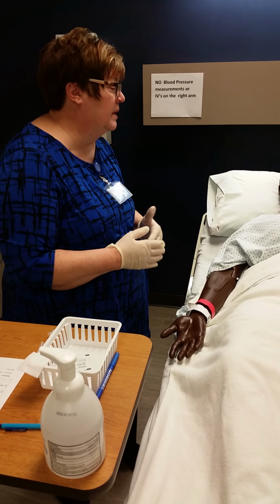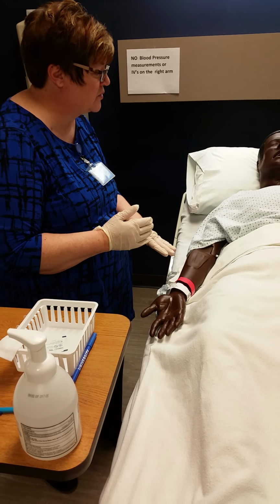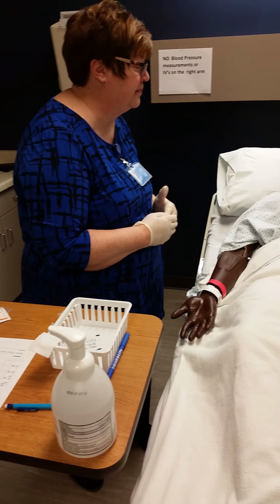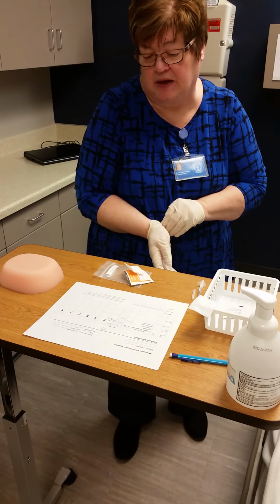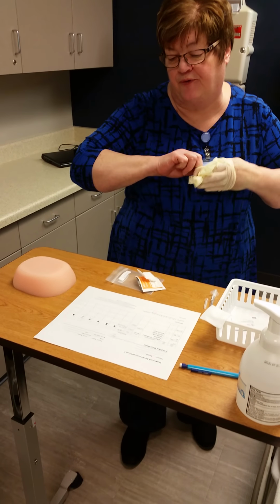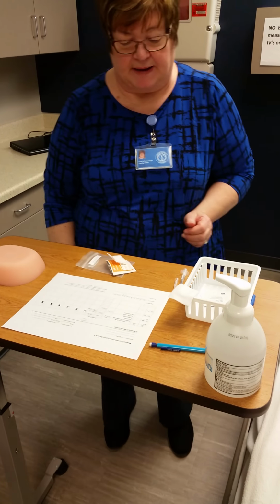Right. And you can do your normal activities of daily living, take a shower, there's no problem at all, okay? Just try not to scratch it now or to press on it, okay? It'll be absorbed by the skin naturally. Okay. All right? Bed in lowest position, call light within reach, gloves off. Document then your time and your initials, and then where you gave the site, which would be the right forearm, the underside, and then signing off your name on the bottom, okay?